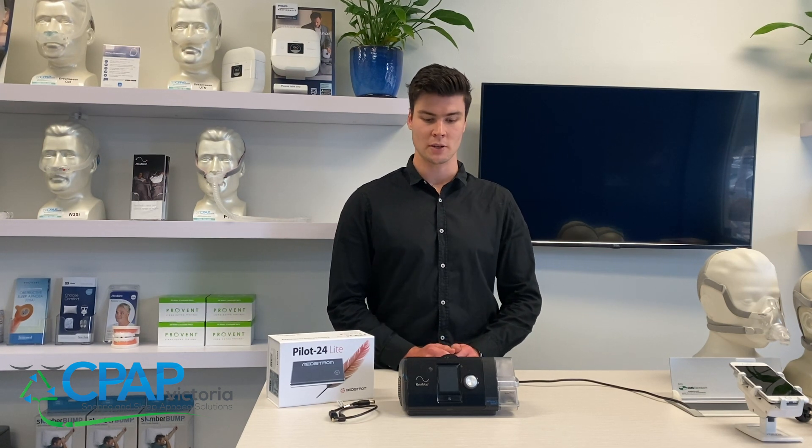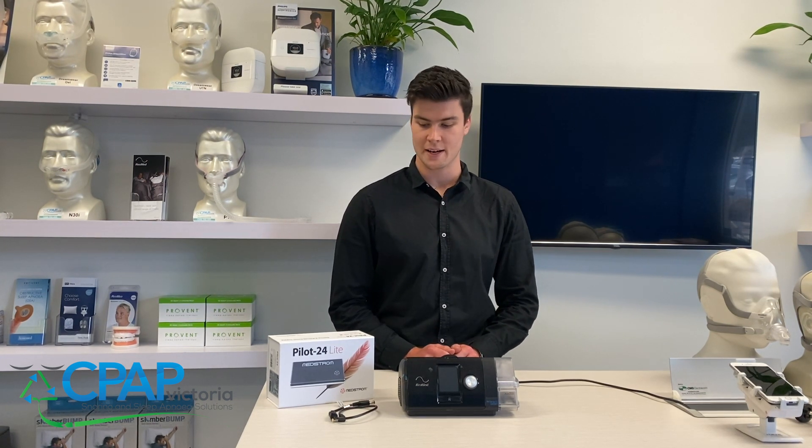Hi, my name is Eli and I'm going to be talking you through a tutorial of how to set up your Pilot 24 light battery with the ResMed S10.